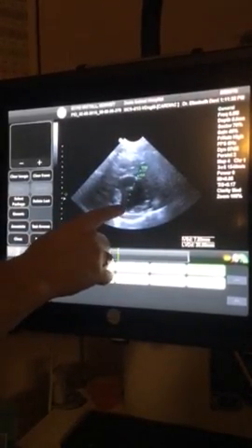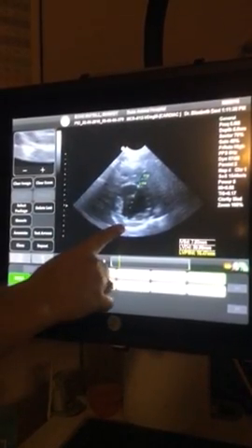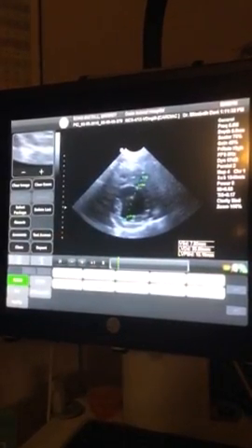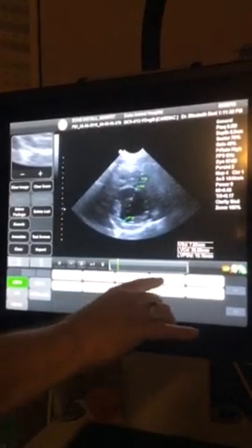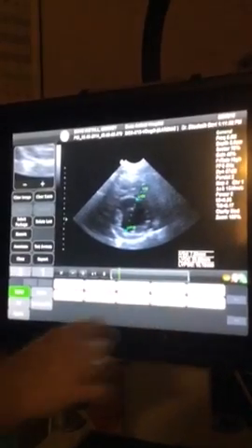Okay, so we'll touch that caliper. The third one is the posterior wall, which you're going to take down to the white line or the pericardium. Okay, if you see 4, 4, and 4, we're good here, so we're going to hit number 1 to lock that top row in.